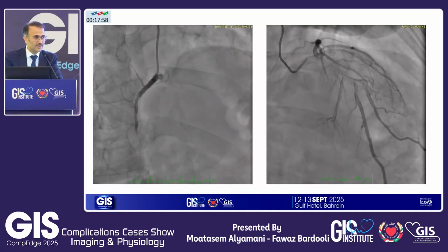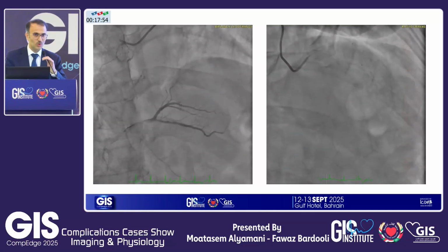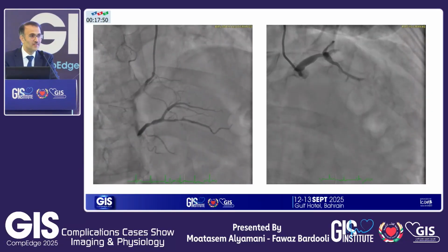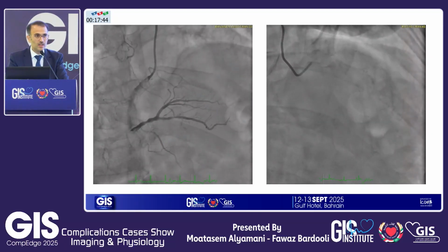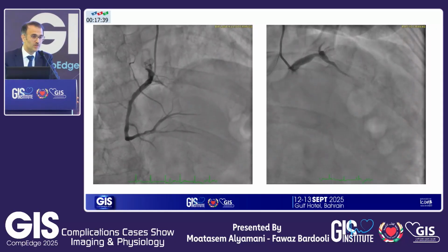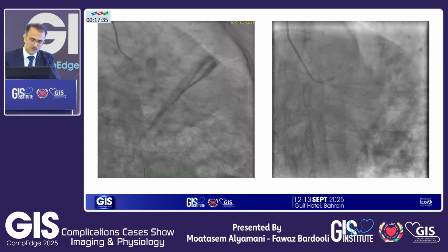So this is a case now in your cath lab. I want to hear from you guys, what do you want to do? The mic is there, we want to listen. Okay, so that's the first thing you will ask. You want to have other images and other views, and that's what we do. So 20 years back, there is a lot of modalities. This is what you ask, and this is what you will gain.